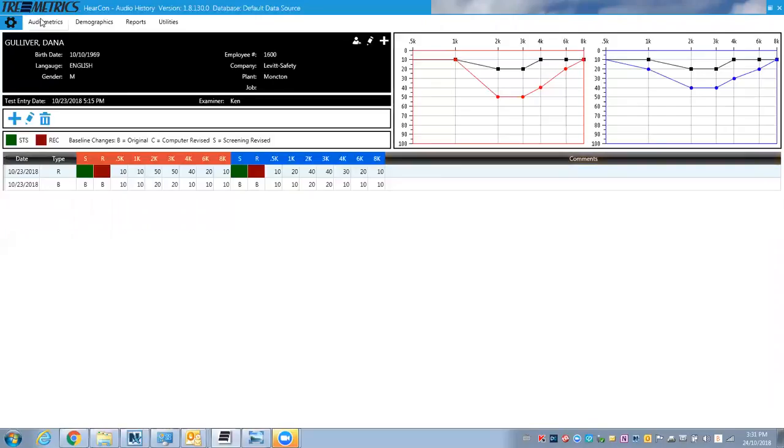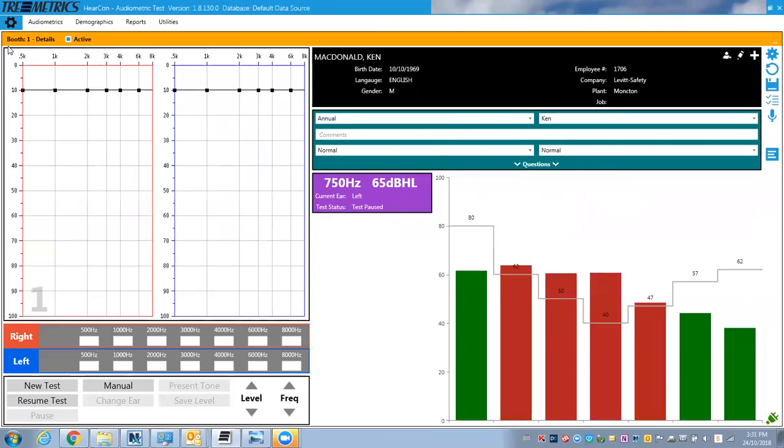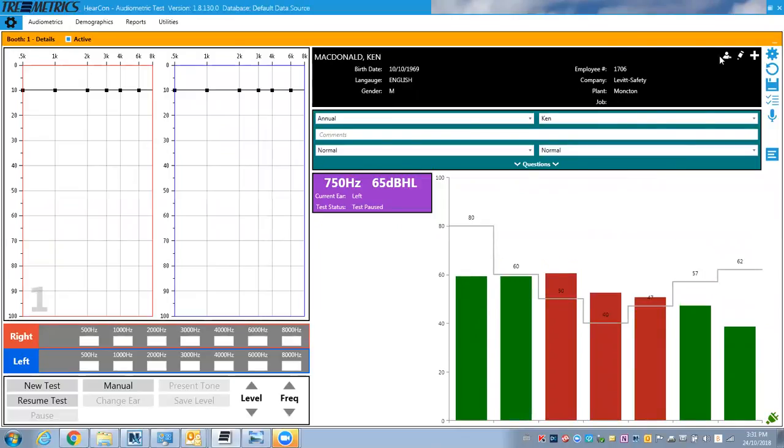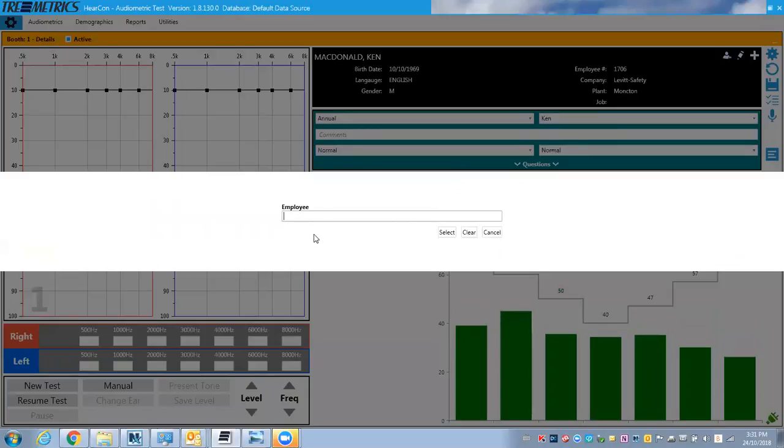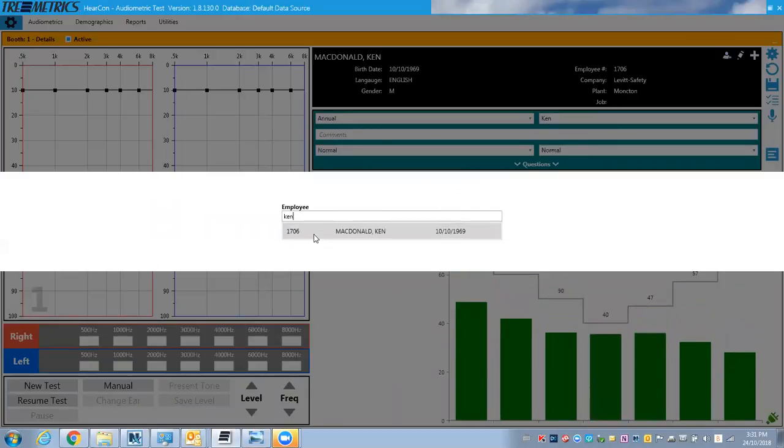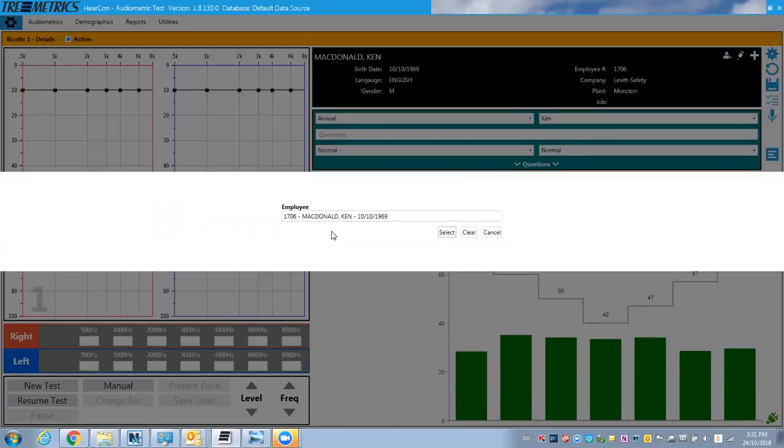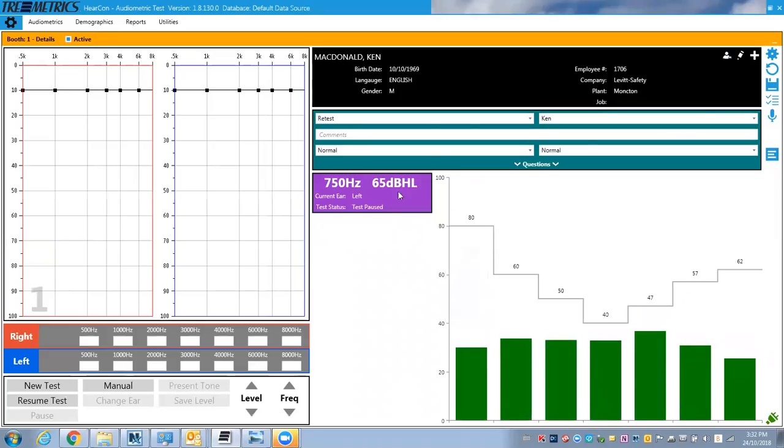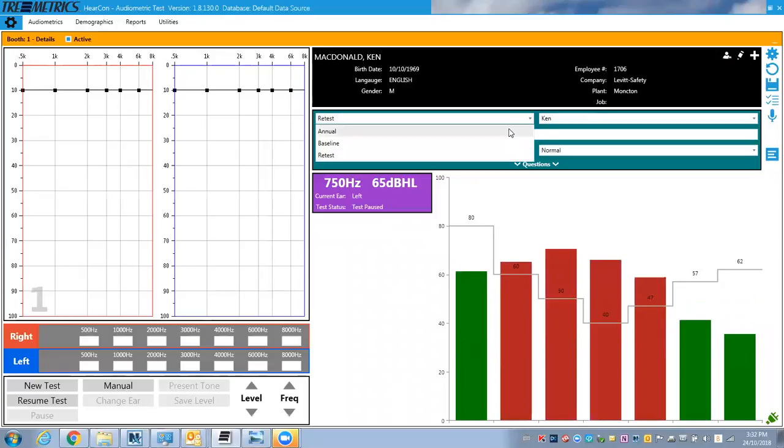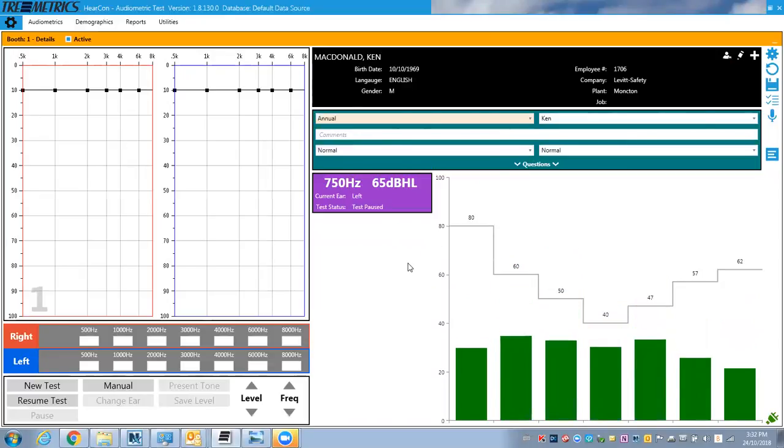So let's go and actually show you how a test is performed. So if I want to switch to someone else, which I'll set it to me, and I'll set it for an annual.